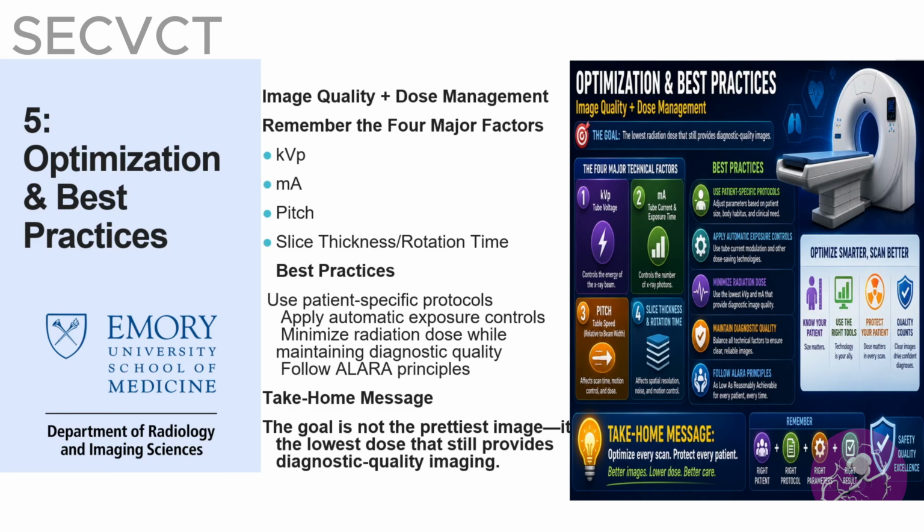Remember the four major factors: your kVp, your mA, your pitch, and your slice thickness and rotation times. Best practices: use patient-specific protocols. Apply your automatic exposure control. Minimize radiation dose while maintaining diagnostic quality. Please follow your ALARA, but please still get the best diagnostic image quality for your patients and for your physicians, please. And obviously for your patients. We are here to be patient advocates, so we do not want those repeat exams and the exams that our physicians cannot read.